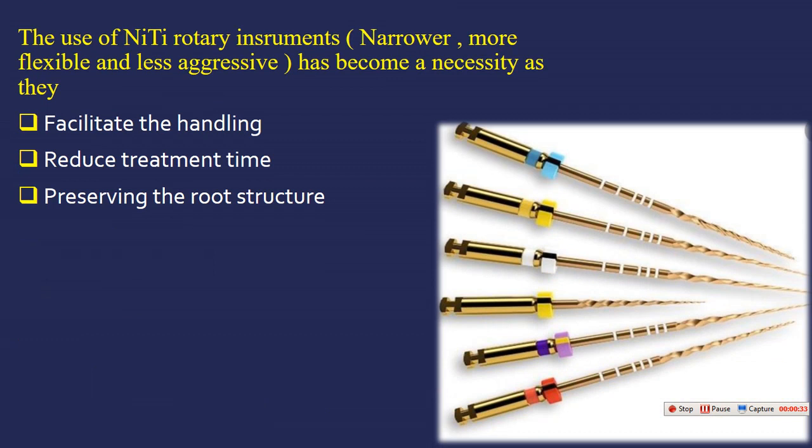As we know, the use of NiTi rotary instruments, narrower, more flexible and less aggressive, has become a necessity today because they facilitate handling, reduce the treatment time, and preserve the root structure as much as possible. Also, we need to reduce the number of instruments to achieve this.